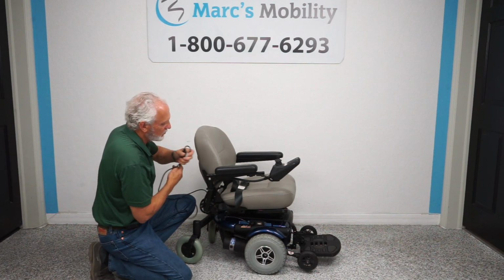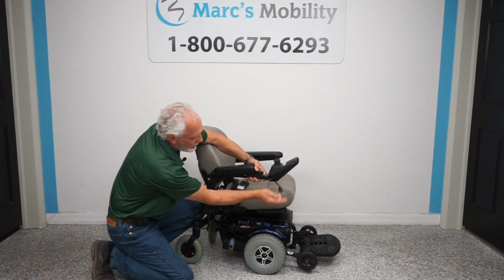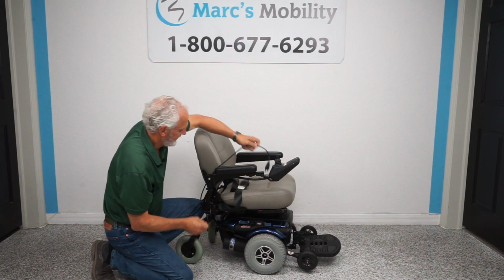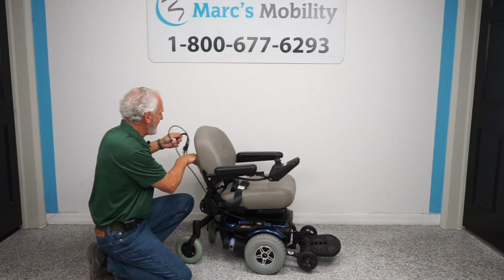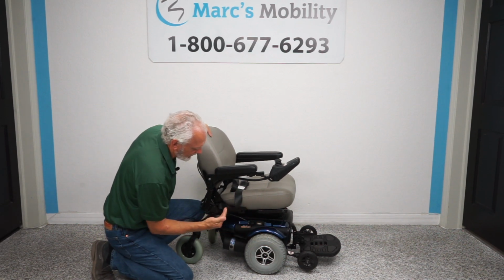We've even got people who run their cord under here like this, so at nighttime they plug it right here on their extension cord. They don't have to go in the back. That's all they have to do, okay? But if you want to keep it in the back, you can keep it in the back. And as soon as the amp meter goes back to 0, you're full.